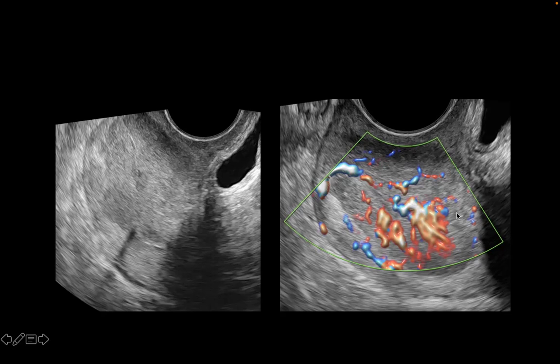And as I said earlier, always switch on color Doppler when you're assessing the cervix. Here I switched on power Doppler. And what you can appreciate here is this marked vascularity, which is quite haphazard, irregular. It doesn't have a characteristic feeding vessel or anything, but quite a haphazard kind of vascularity, which is highly suggestive of neovascularization seen in cervical neoplasia. So this was a case of a cervical cancer diagnosed on ultrasound.